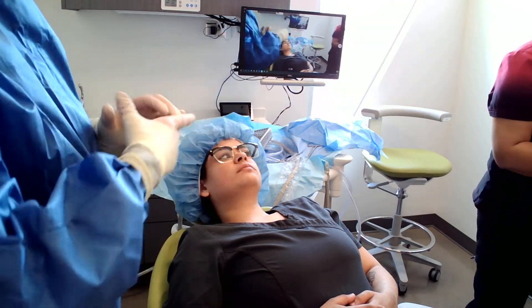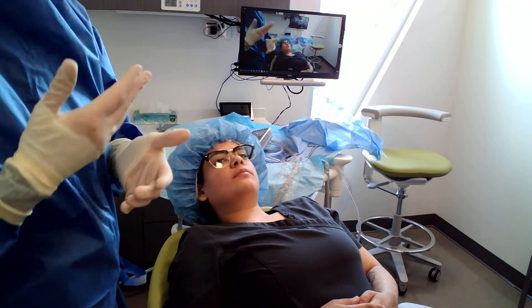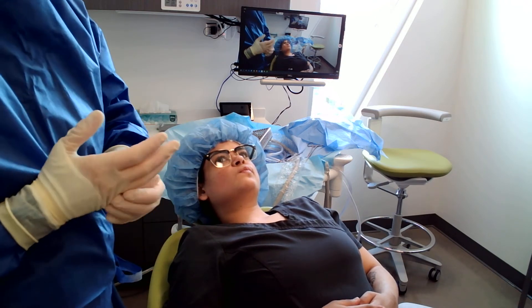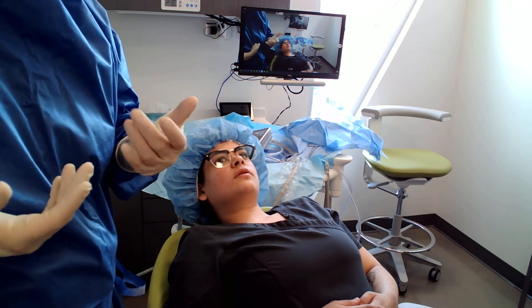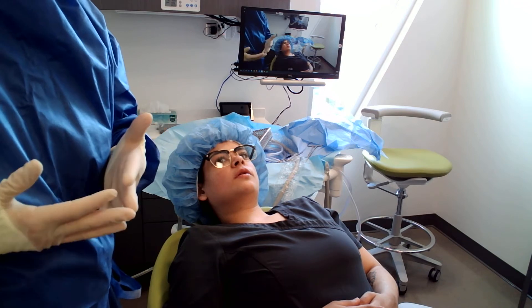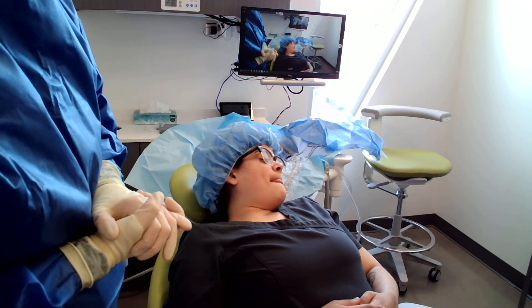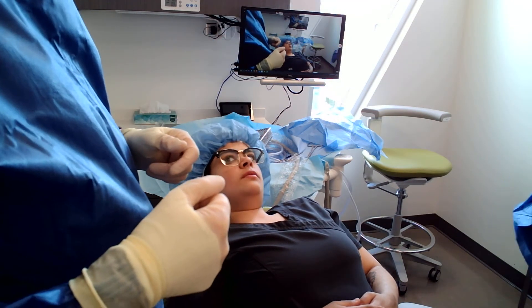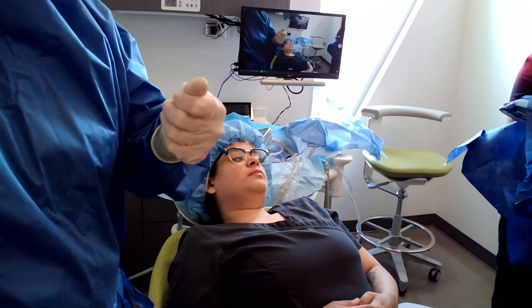Then I'll get you to open the split sheet. With doing the face prep, we're reducing microbes because our skin is not sterile, and we're going to be touching the outside of Courtney's face with our gloves. You can grab it right out of there, then open the outer part. And you see how Nina's doing that away from her body.